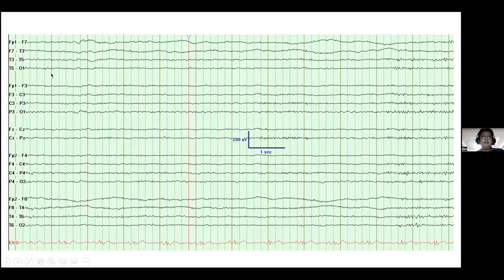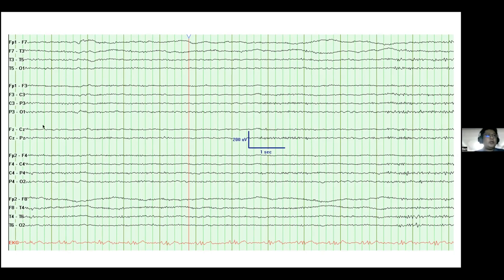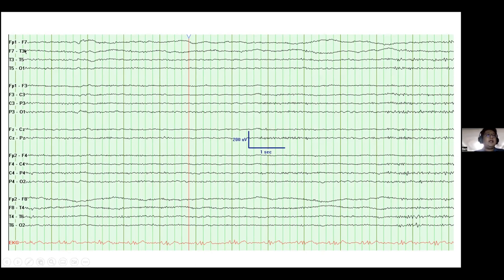It is 10 Hz because in one second you can count 10 waveforms. Another EEG example shows that the alpha activity is not obvious posteriorly. If you look at the frontal leads like FP1, F7, FP2, and F8, you can see very slow horizontal eye movement — this signifies a drowsy state. There is also low-amplitude fast activity in the beta range in the frontal-central region, together with alpha dropout.